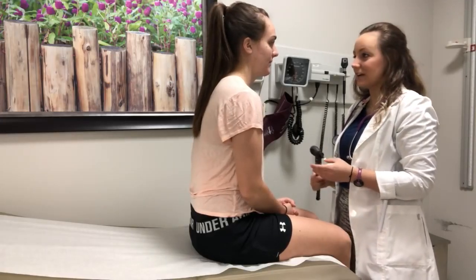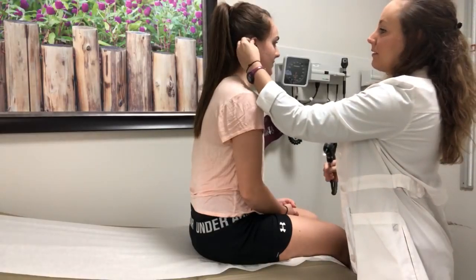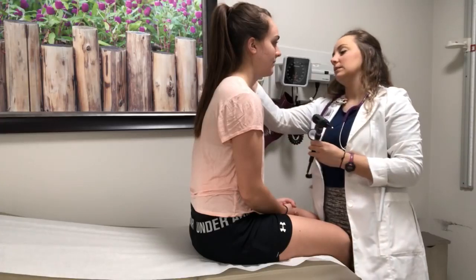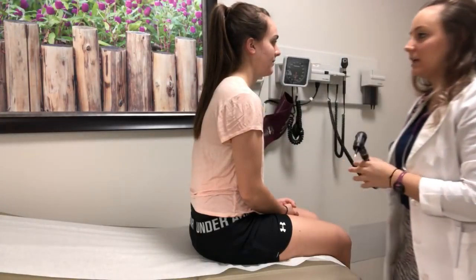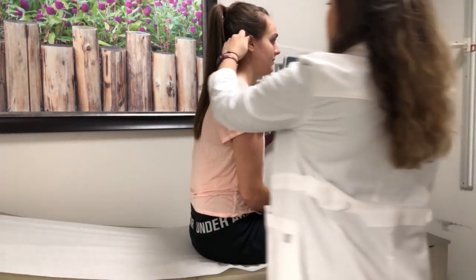Okay, now I'm going to look at your ears. Okay, so I'm going to palpate your auricles. They're symmetrical on both sides. I don't feel any nodules, no tenderness, no swelling. Are you having any hearing loss, any ringing in your ears? Awesome. Okay, I'm going to look in your ears.